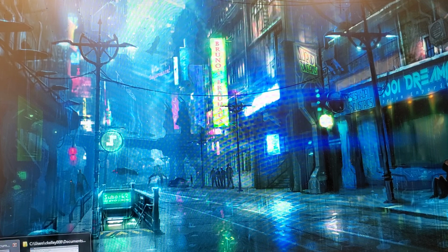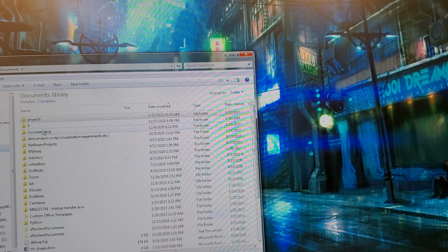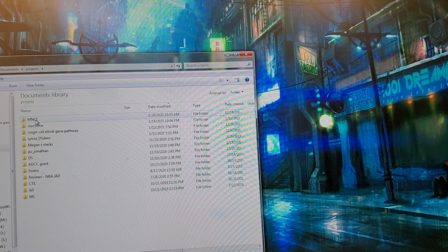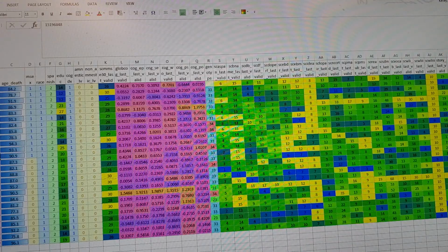Let me pull up the subjects sheet. And very importantly for you to know, all of this you're doing blind, which means that you don't know what Braak score or Thal score applies to what person. We usually work with Braak because we're a tau lab.